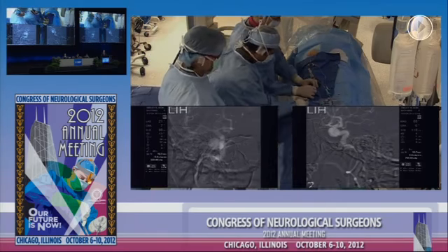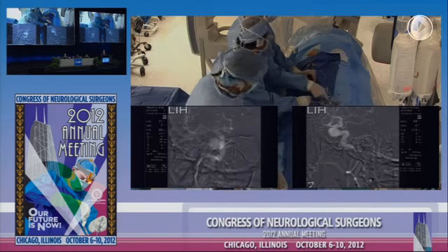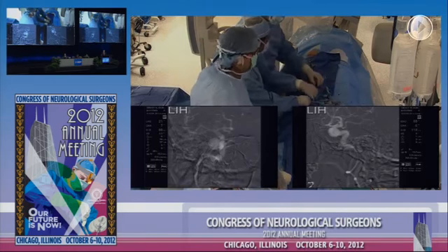So we're going to get a new road map because she did move. Let's get it up there. Okay, hold it up there.